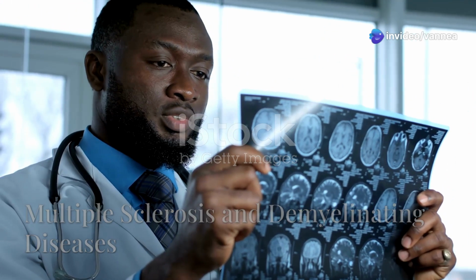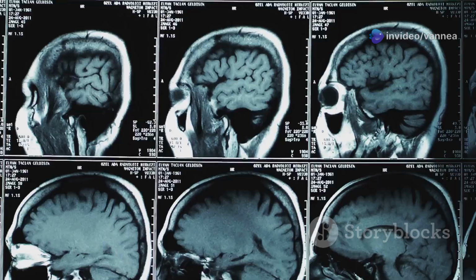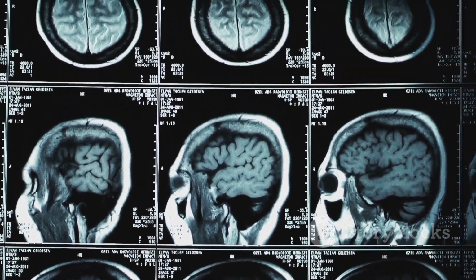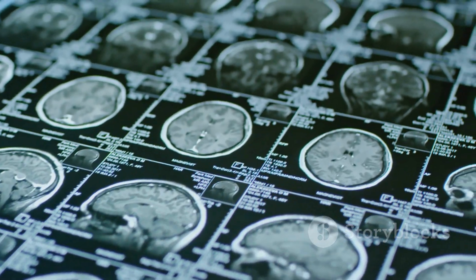So let's talk about multiple sclerosis and other demyelinating diseases. Demyelination can actually involve the optic nerves, which is cranial nerve 2, or the brainstem, and that can affect other cranial nerves as well.